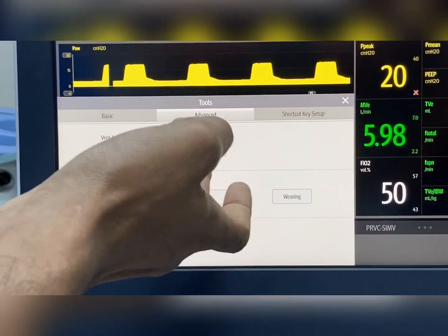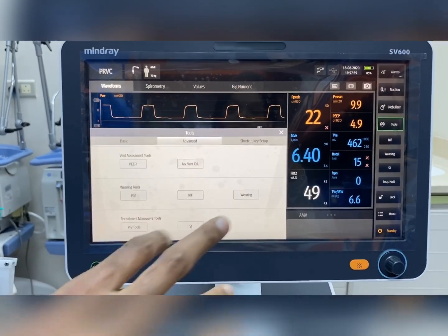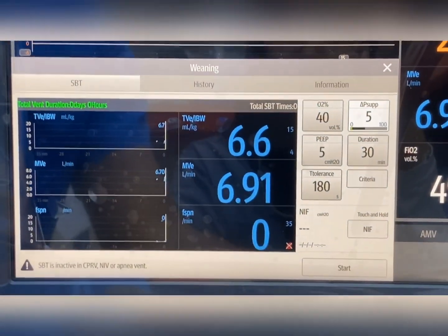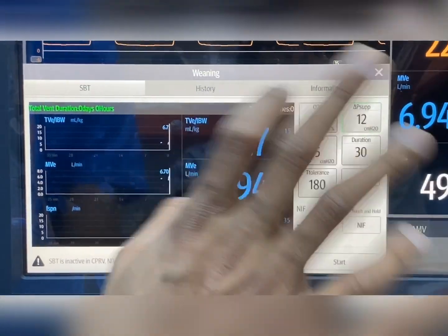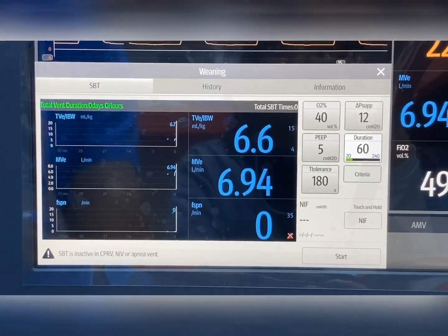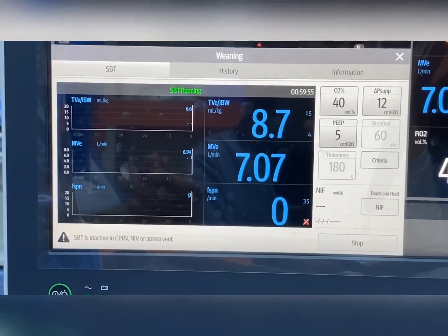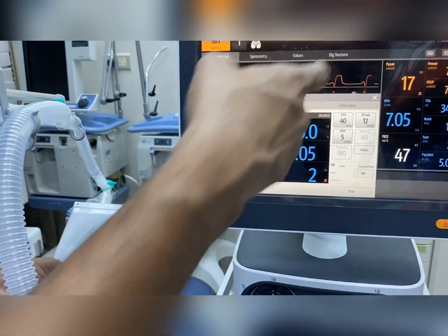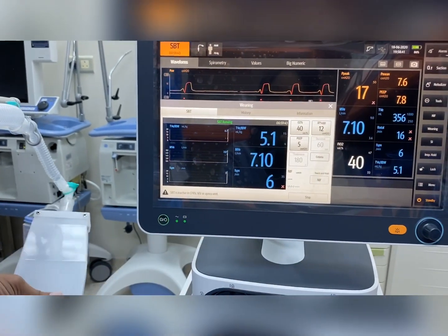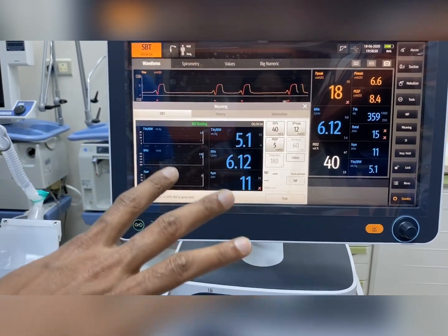The next option is weaning tools and weaning parameters. The first is occlusion pressure, and NIP can also be measured. There is a special weaning option where you can set pressure support — for example, pressure support of 12, PEEP of 5, and FiO2 of 40% — and set a time for the trial, such as 1 hour. Once started, the machine goes into SBT (spontaneous breathing trial) mode. The patient initiates breath, and after the preset time of 60 minutes, the patient automatically goes back to the previous mode.